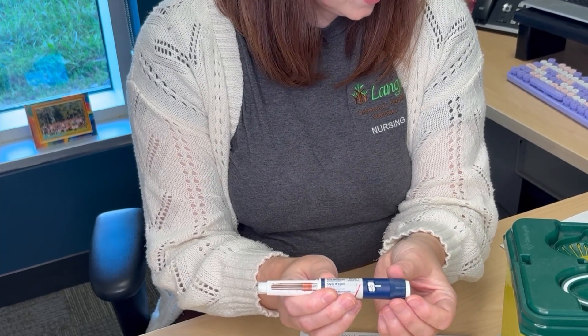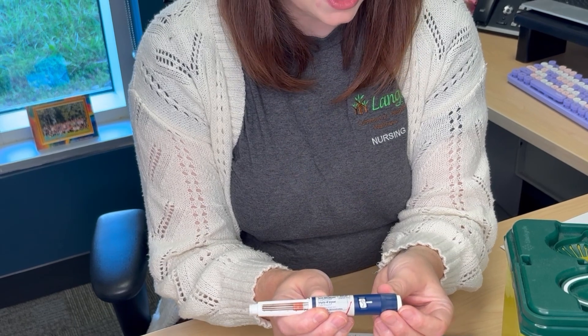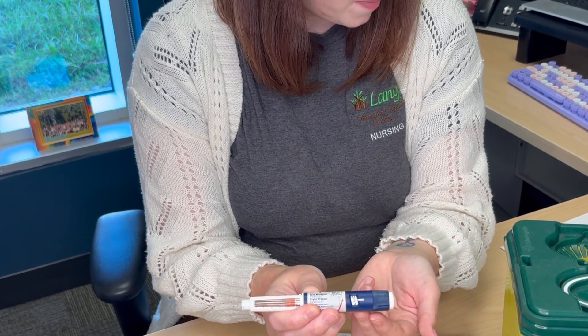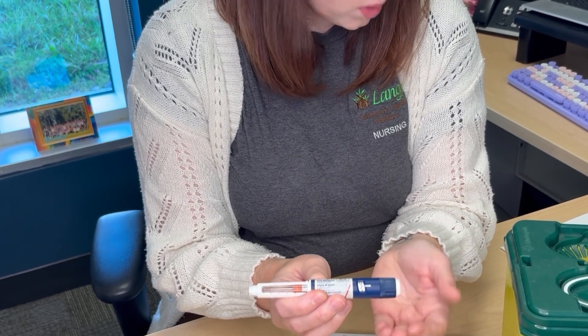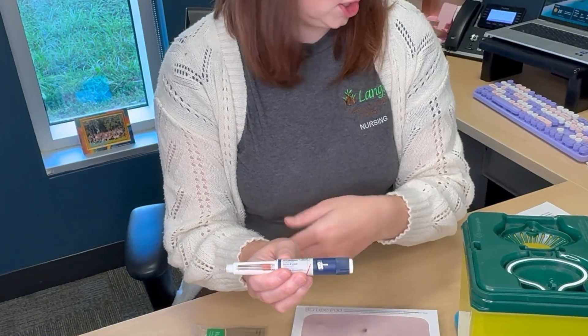After you've primed it, you can then choose the dose or number of units that you are currently taking using the dial on the pen. Once you have your dose dialed up, you can then select your injection site.